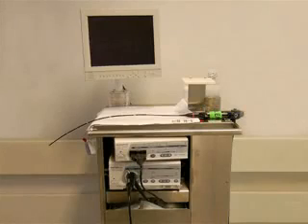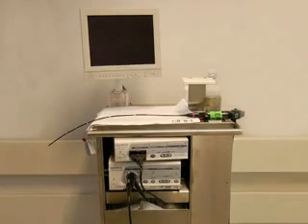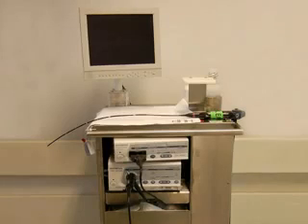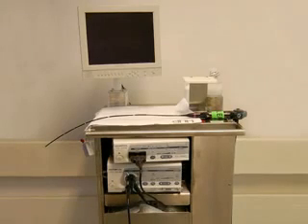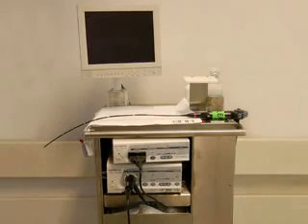The equipment required to perform a fiber optic intubation includes a fiber optic scope. Lubricate the scope prior to the procedure, taking care to keep the tip and camera lens clean. A monitor connected to the scope is helpful for improved visualization and for teaching purposes.